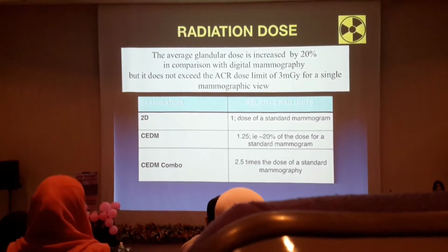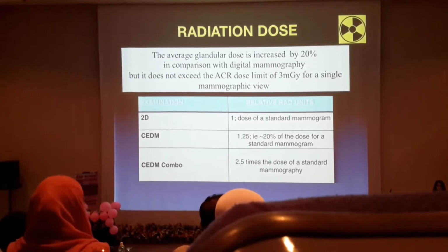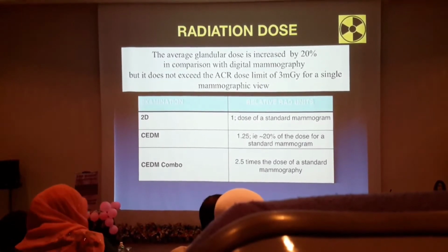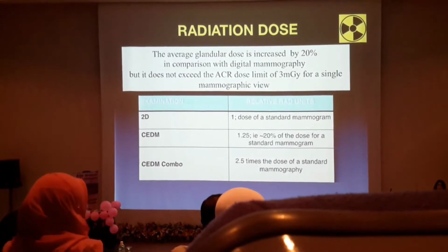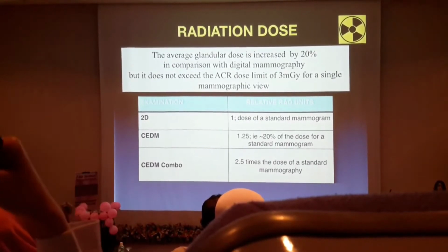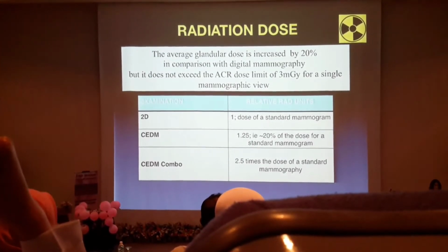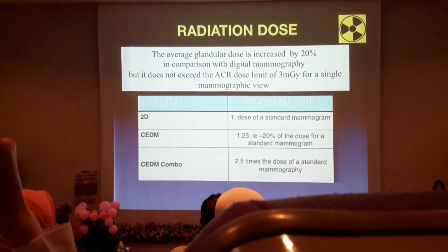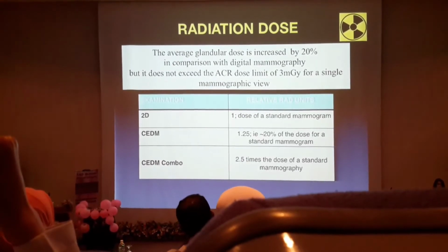suspicious mass. So I work right now in HKL, we are a tertiary referral center. So what we have is on Tuesdays, we have walk-in clinics where our surgeons get all these malignant lesions referred to them. And they give us a call and they say, okay, this patient has a very suspicious lesion. And just to make sure, when they come to our unit, sometimes I will put a probe on it to make sure that we are not dealing with a cyst and we are dealing with a mass.